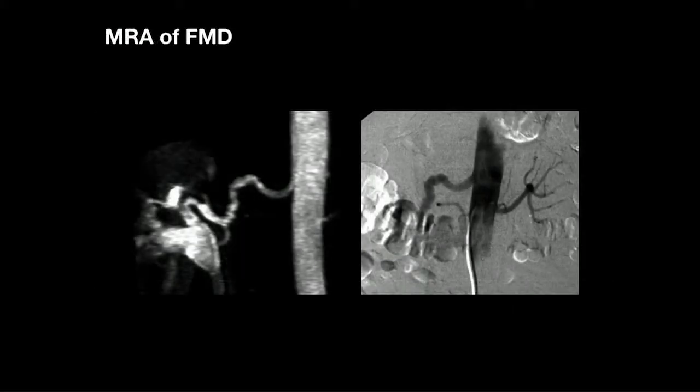This is FMD, okay? So this is a doctor who, when they were training as a medical student, had hypertension, and they had all the tests of the day as a medical student, including an IVU. And they said the IVU was normal, and therefore they didn't get further investigated. Well, the IVU probably was normal 30 years ago, but later on when we did a contrast-enhanced MRA, we thought, well, actually, this looks like FMD, and here's the correlative DSA of the same customer there.